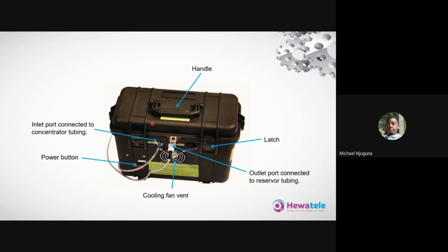And it is attached at the top part of the filling station, which can also open up. And as you can see, there is a latch here and also a latch on this other side, just to make sure the top cover is well closed during operation of the device.